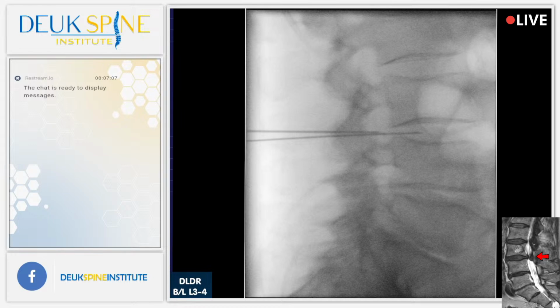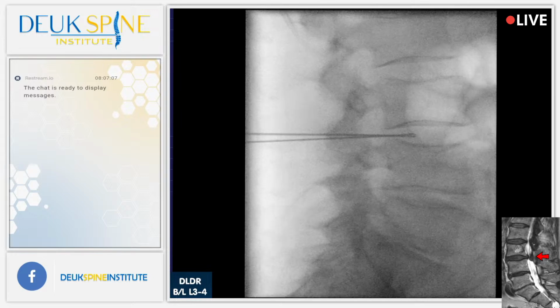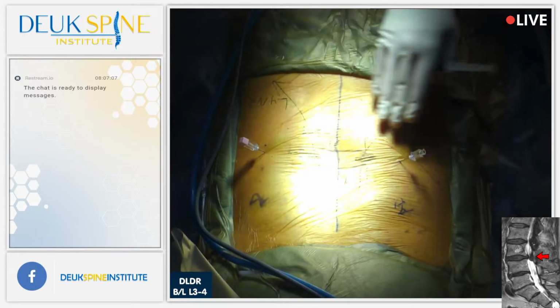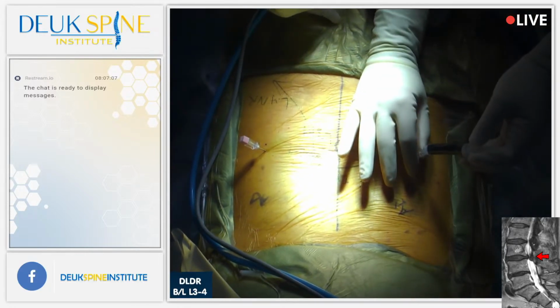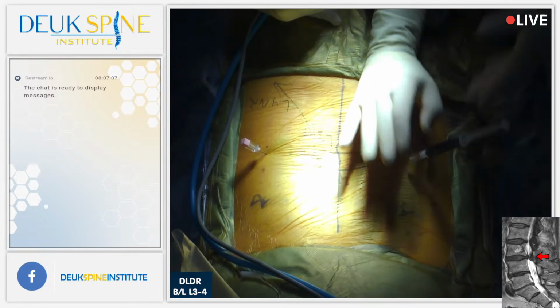All right, so we're about to enter here at L3-4 on my side. We're in like Flynn. You're okay. Relax. All right. So now we have successfully navigated through the tear in the back of the disc at L3-4 on both sides. And we've avoided the nerve roots, so we're safe. We're not going to have any nerve injuries, because the patient would have told me.